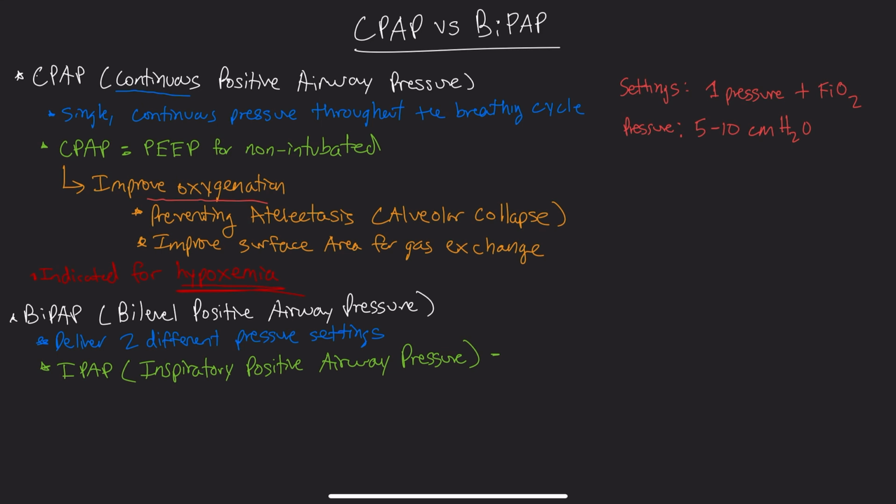So basically it's going to give the patient a little boost, right? Which is going to help them have larger tidal volumes, so take bigger breaths. And we'll talk about why that's important when we get to hypercapnia and blowing off more of that CO2. So what this does is assist inspiration, which is going to lead to larger tidal volumes.